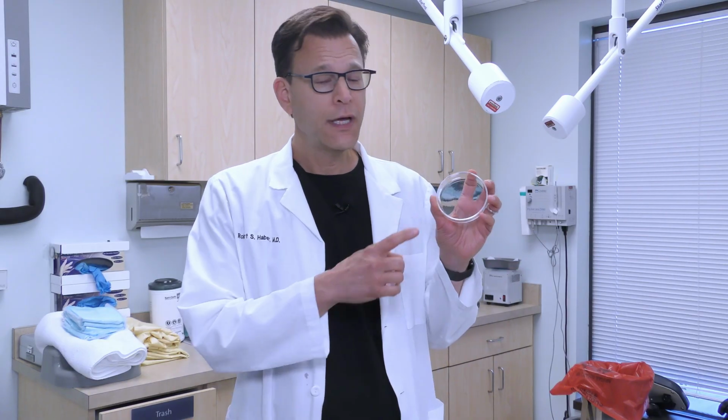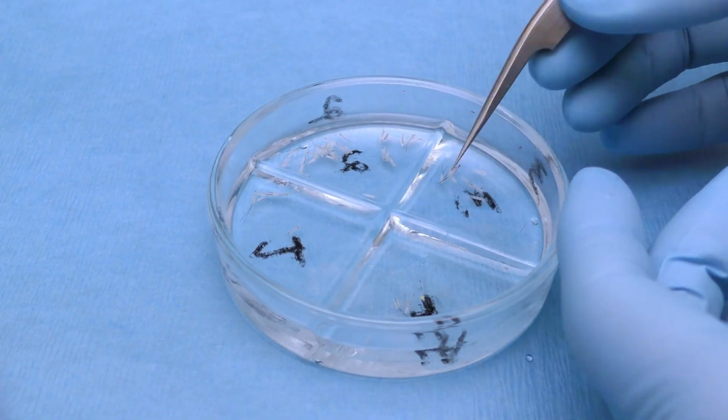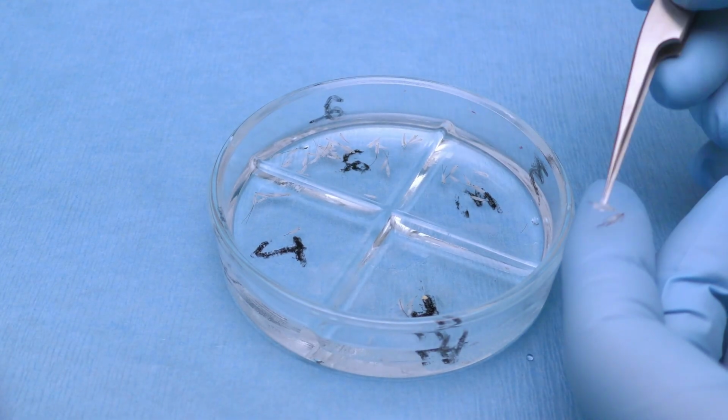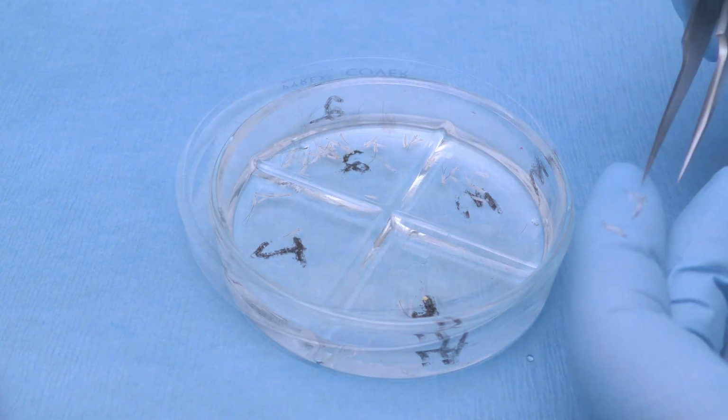Regardless of whether you harvest your grafts by strip or FUE, you will at times have hundreds of grafts awaiting implantation. How you store and care for these grafts is critical to their survival. Since the earliest days of hair transplantation, hair surgeons have used the Petri dish because they were readily available. But grafts floating in a Petri dish cannot be separated by follicle number. So Petri dishes divided into quadrants were used, but some of us find that grafts can become overhydrated when floating, and fishing out free-floating grafts can be like a carnival game.